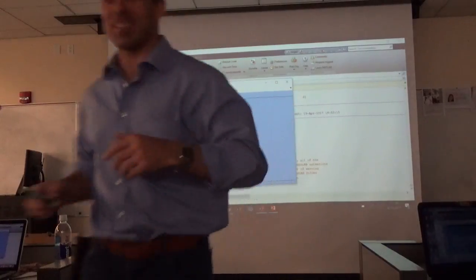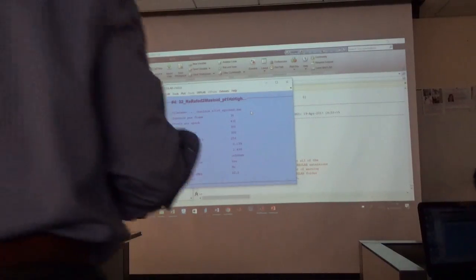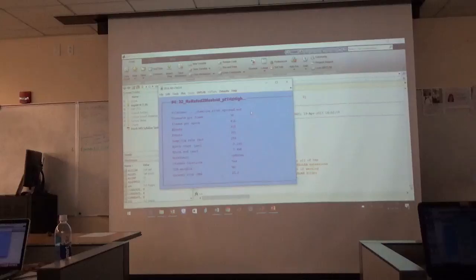Let me take a quick look. It did work. Good news, it still worked. It still worked for everybody. That's still history for us. So great job. Didn't that work? Well, not that it doesn't work, but okay, we'll sort it out. Is it supposed to say epoched at the end of it? Yeah, you need to add epoched at the end of it. There you go, just like that.